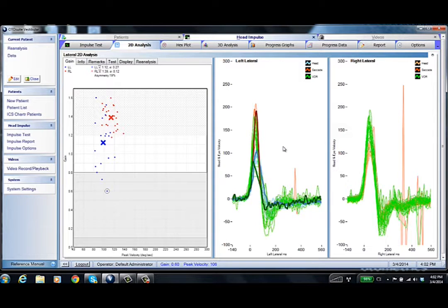So what happens is that the eye trace is so sharp, and like Ian calls them like a saccade, he calls it a stalactite. But because this back end is so inclined and the eye movement is so sharp, the desaccader algorithm thinks it's a saccade. So it's going to take that saccade out, and then you're left with the VOR component, which is this little green line here.